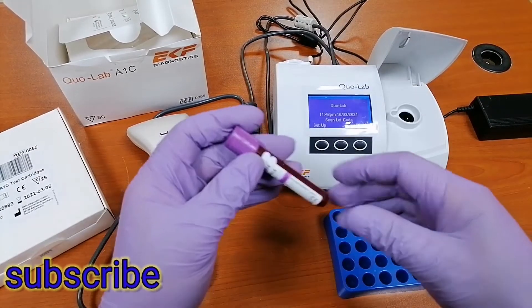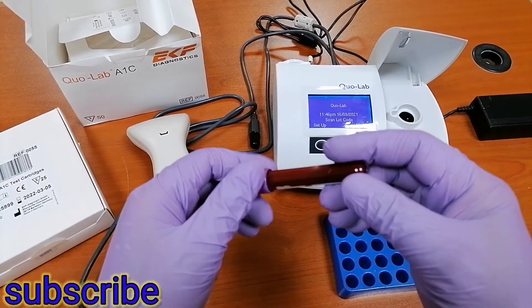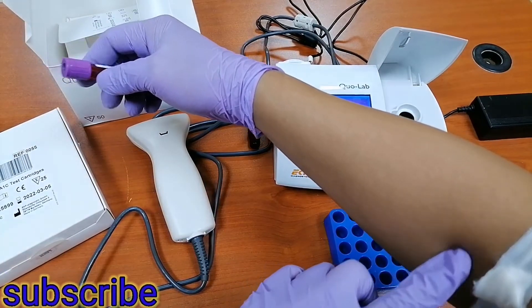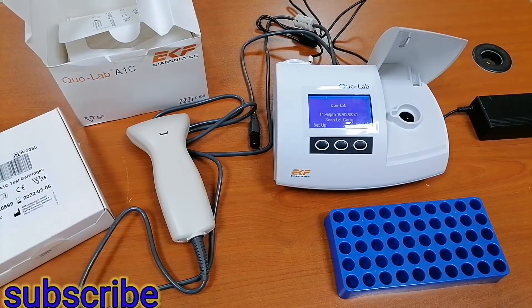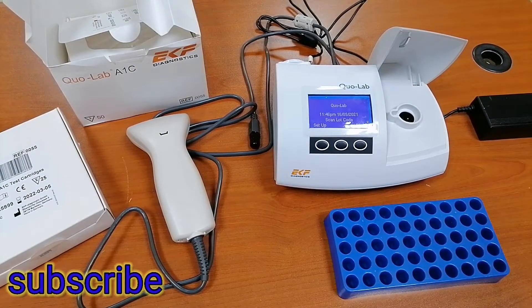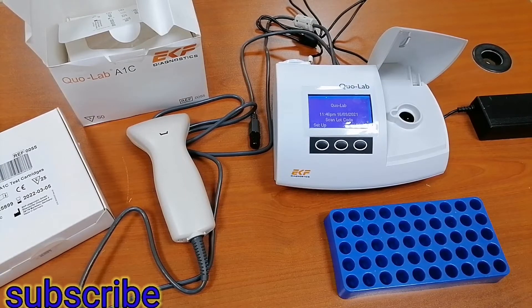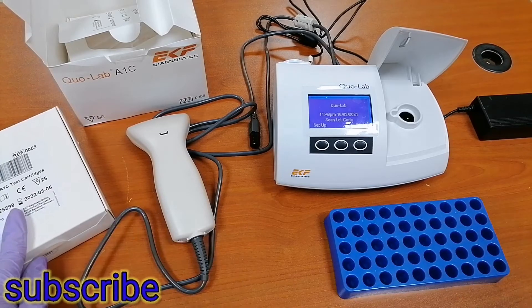So now I already have a blood sample here extracted from venous. This is my own blood. I will test how much my HbA1c is — since I don't know my HbA1c, we will test it in this machine.